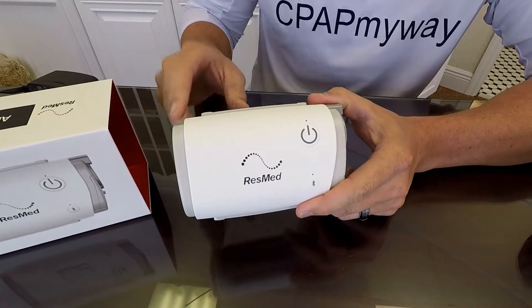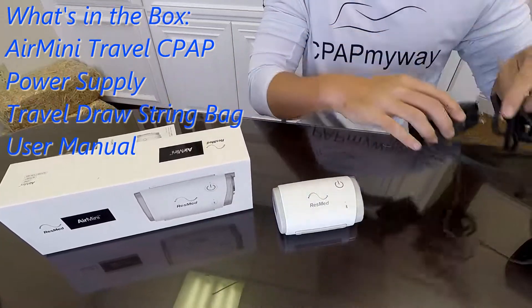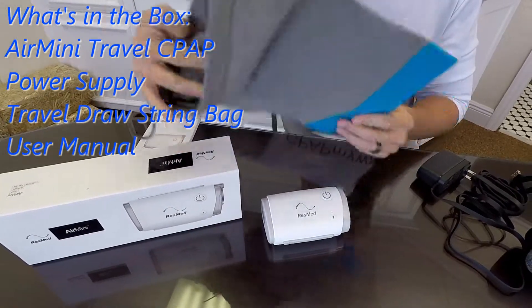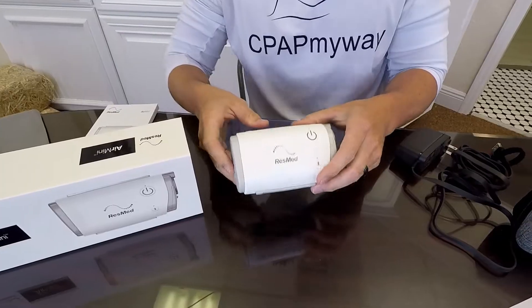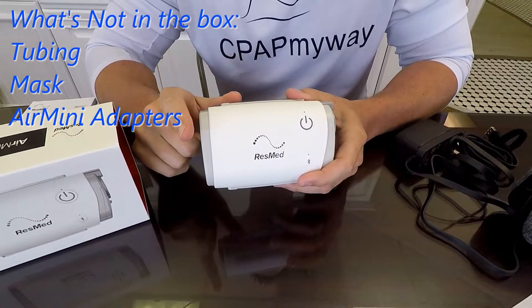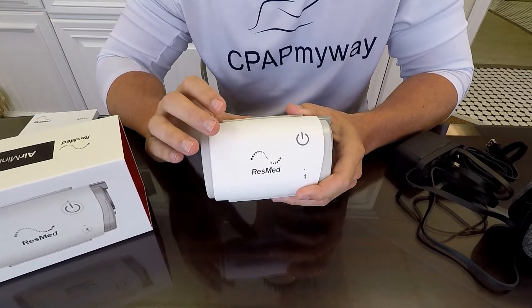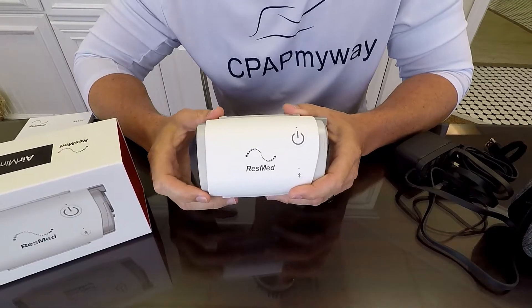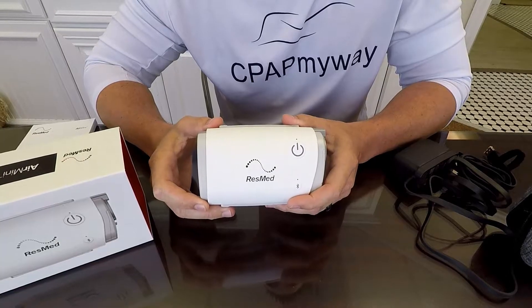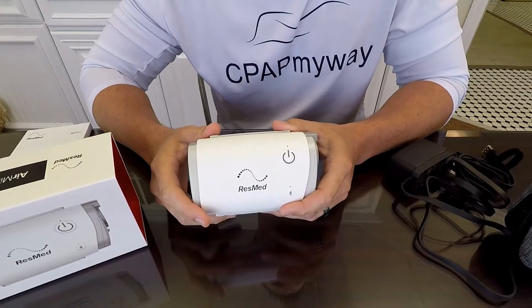When you first buy the Air Mini, it's important to know what's in the box. In your box is going to be your power supply, obviously your user manual, a nifty little travel bag, and then obviously your Air Mini. What is not in the box is your Air Mini-specific tubing or the Air Mini-specific mask. You will have to make sure you get that product separately if it's not included with the purchase of the Air Mini. It does not come with the tubing unless you're ordering the kits separately or it's included.